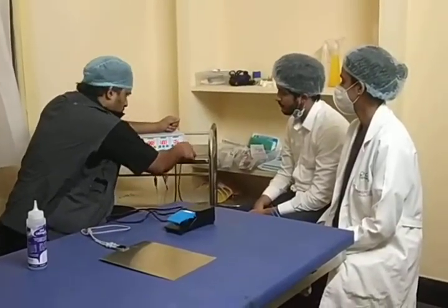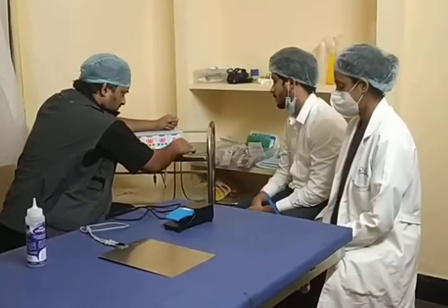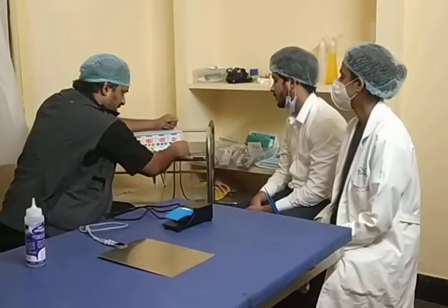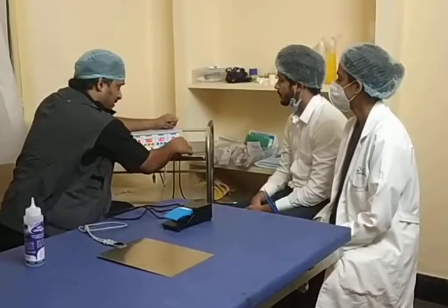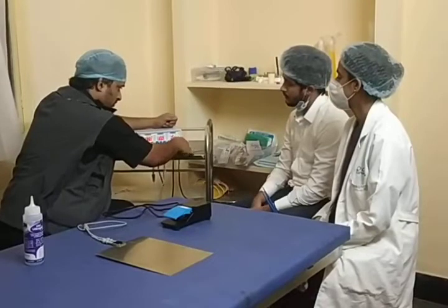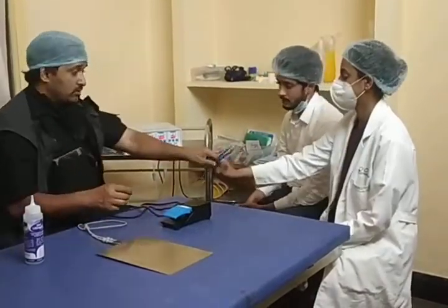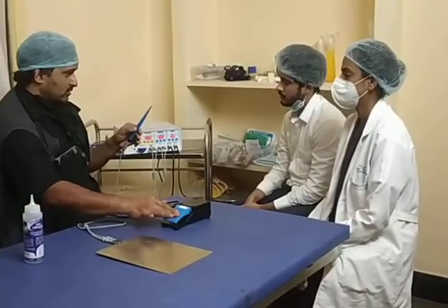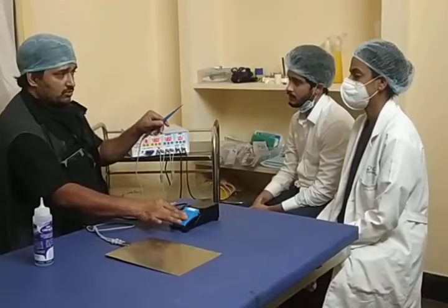Very straightforward, so don't get confused or upset because there are so many wires and so many connections. Just find out what is needed for your procedure. Just work on one switch at a time. There are instructions, so it should not be a problem. Okay, so this is the bipolar option with my switch. So this is your bipolar option. Can you see sparks over here? This will help you to coagulate.